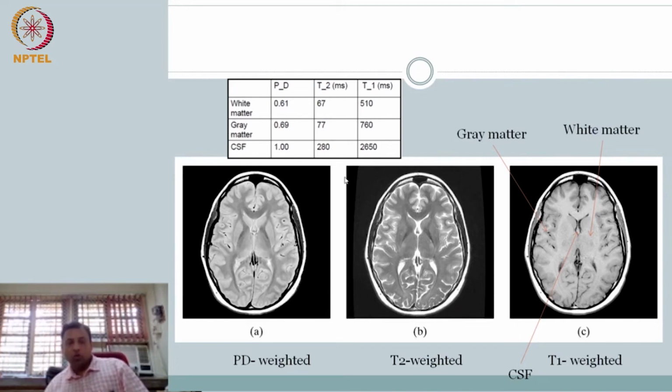So now you know, or at least you guess, that the white and black in each of these and the gray in between has to be related to, or weighted, more correctly to use the language, towards one of the properties. So here the black, white and gray are all weighted based on the proton density parameter of the tissue. Here is likewise T2 weighted, here is T1 weighted.